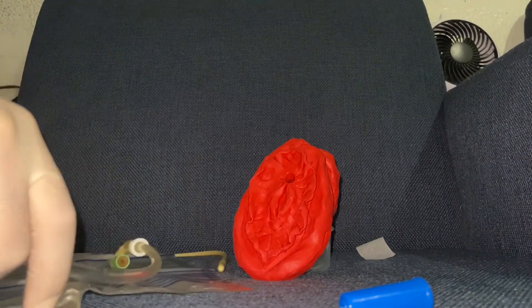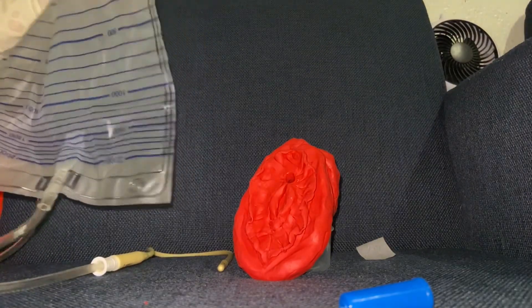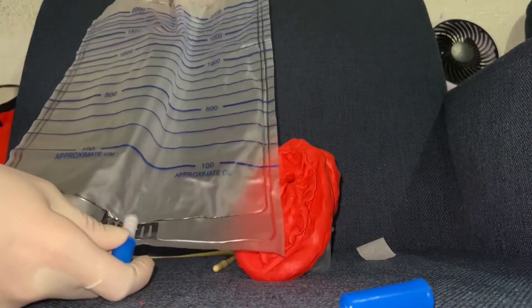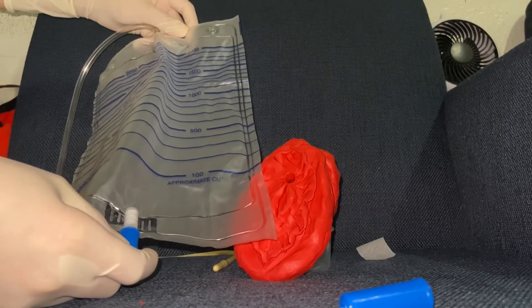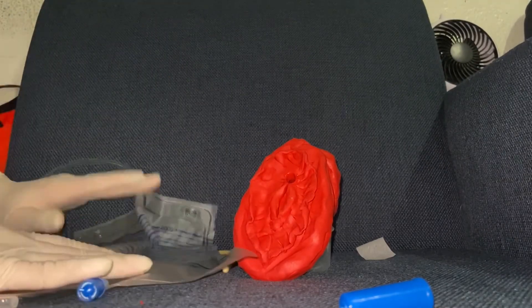Empty the drainage bag and measure the amount of urine, recording it on the intake and output sheet. Remove the gloves and wash your hands. Discard disposable supplies and return reusable supplies and equipment to the appropriate area. Record that the catheter was removed, noting the time, date, and by whom.